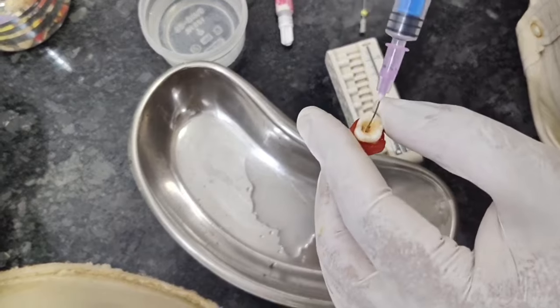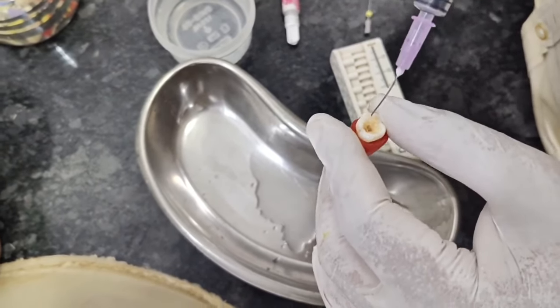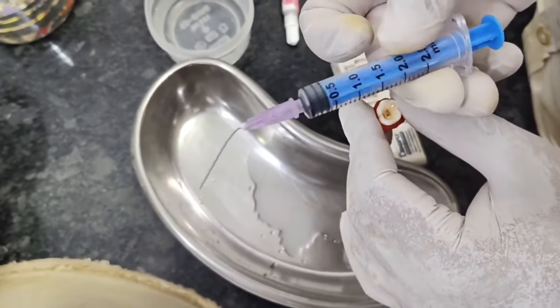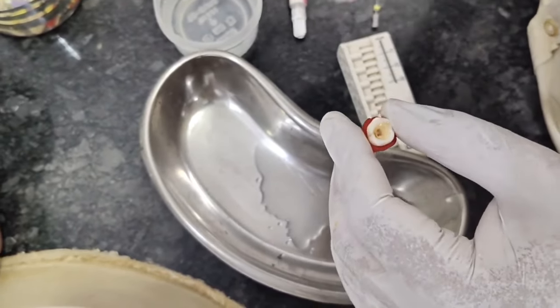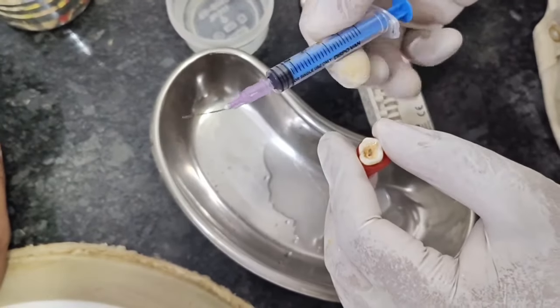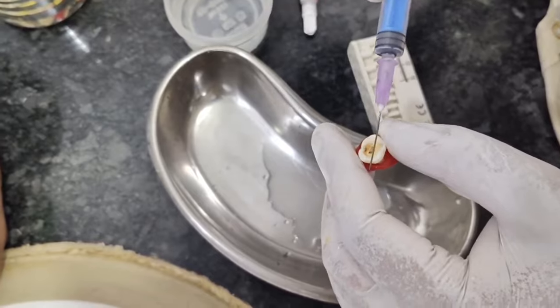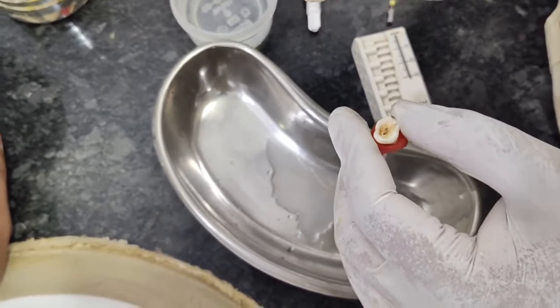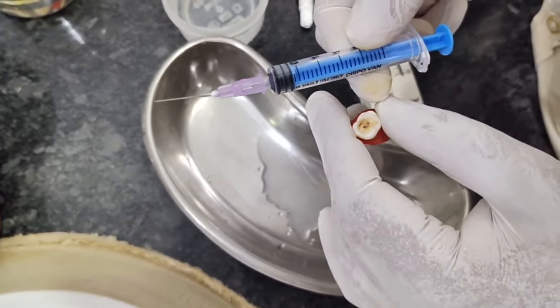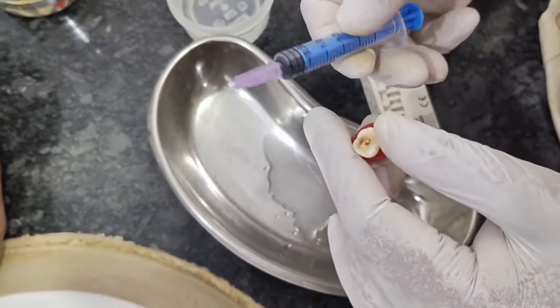Now you have to irrigate each canal with at least 10 ml of sodium hypochlorite. That means this is 2.5 ml, so at least 5 syringes of this. After the BMP has been completed, we have to use 5 syringes of sodium hypochlorite of 2.5 ml in each and every canal. That means you have to fill it with hypochlorite 15 times, 5% sodium hypochlorite, which I use in my clinic.